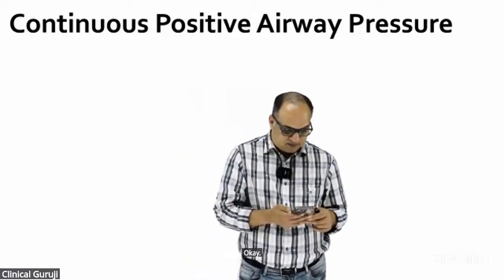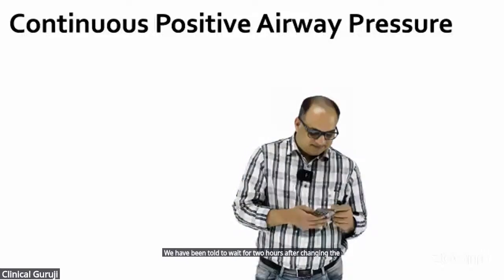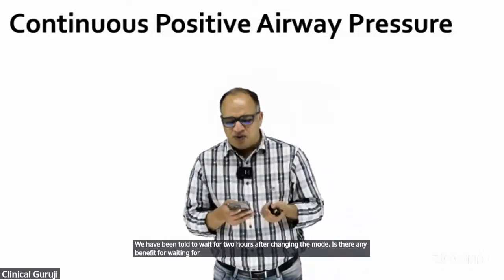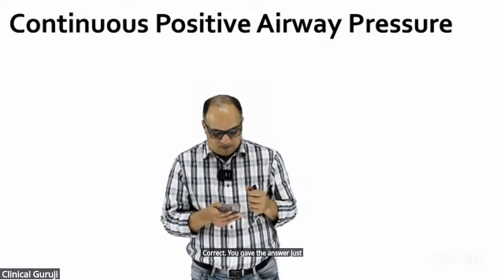We have been told to wait for 2 hours after changing the mode. Is there any benefit in waiting for this long, sir? Not for 2 hours, ma'am. Not for 2 hours. Correct. You gave the answer just now, sir. 15 minutes.